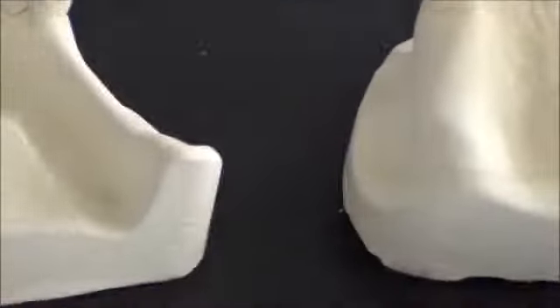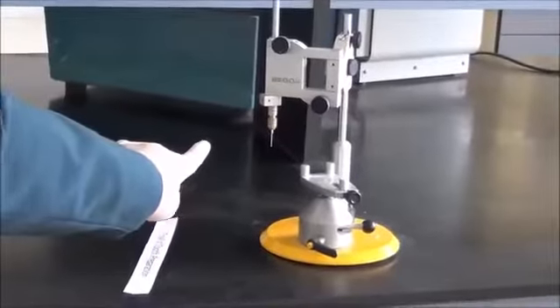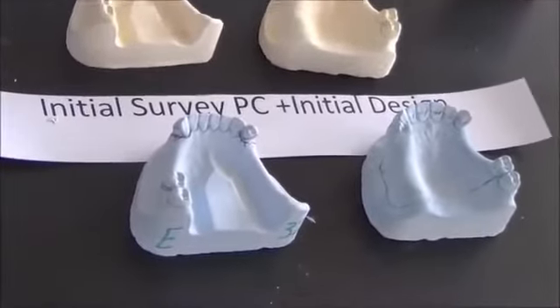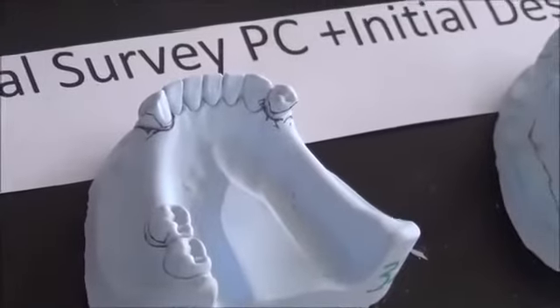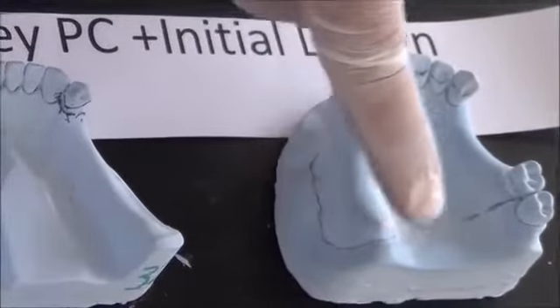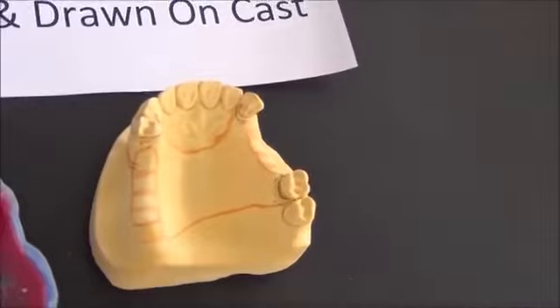For this purpose, I use what we call a dental surveyor. You will take the process of surveying in detail in the next demo. This instrument is used for recording and trying to analyze all of the components of RPD. Once we finish the surveying, we will have some lines drawn on the cast, mainly the survey line. We would have found undercuts suitable for our design. We complete the drawing, trying to draw other components of the design until we reach this design, which has all of the components drawn on the cast.